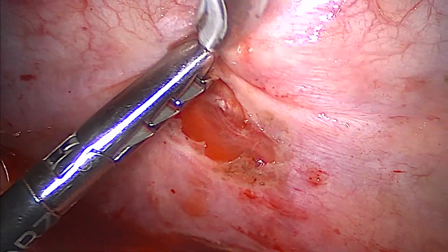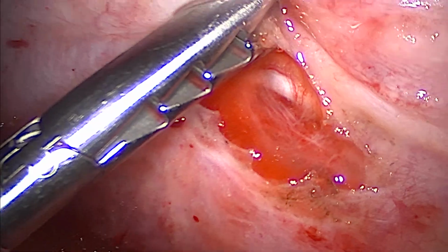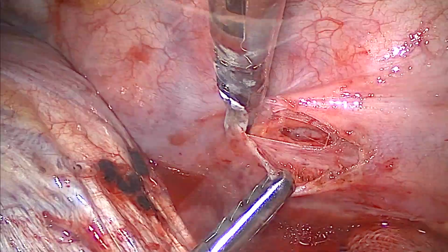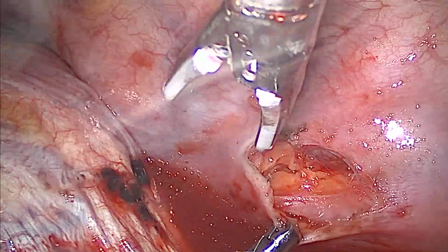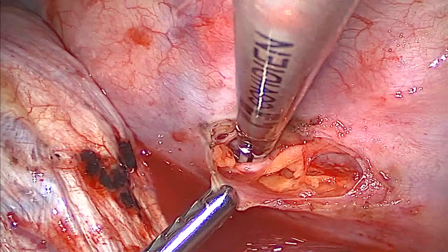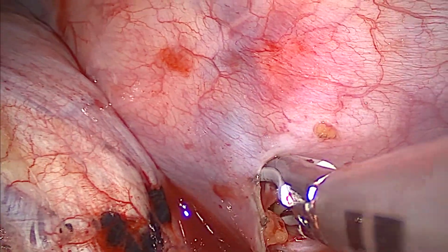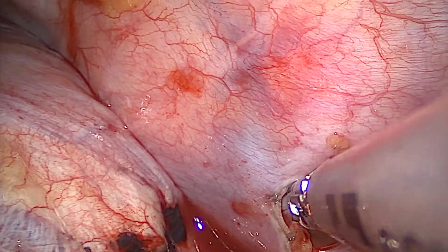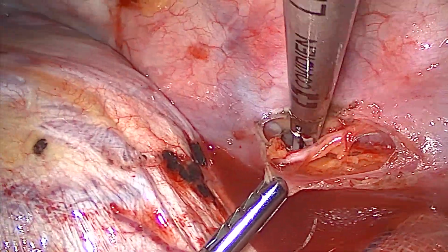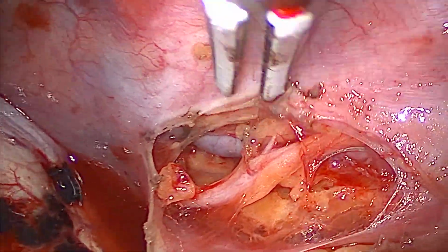It is a very delicate structure, and one has to take utmost care not to injure it during the dissection. Excellent camera holding skills and excellent assistance are paramount in doing these technically challenging operations. Nevertheless, you need an excellent anesthetic team who can take the lung down and put the patient back on single lung ventilation.